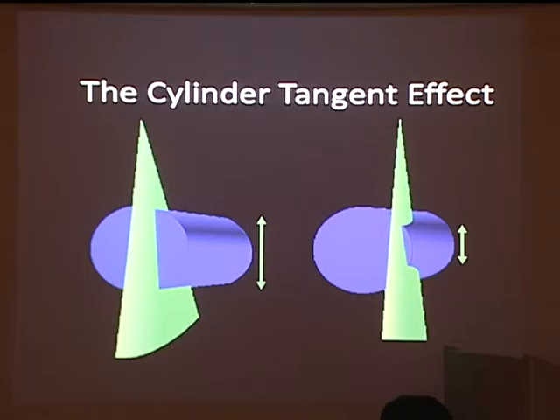It's important that when you measure the aorta, you see it in axial view and long axis view. You can measure it in these two ways, or the better way is to measure the aorta in short axis view, but make sure that your transducer is perpendicular to the aorta.